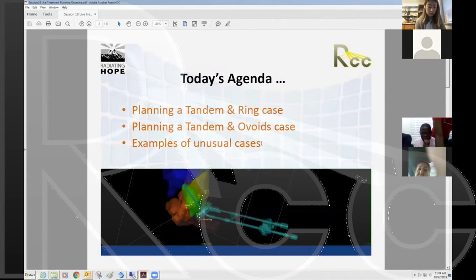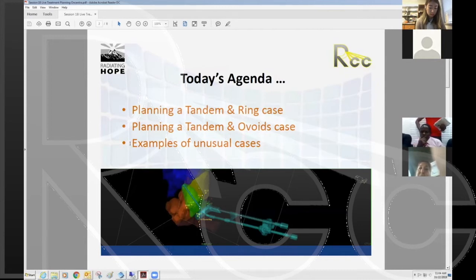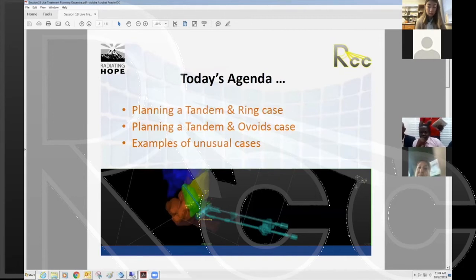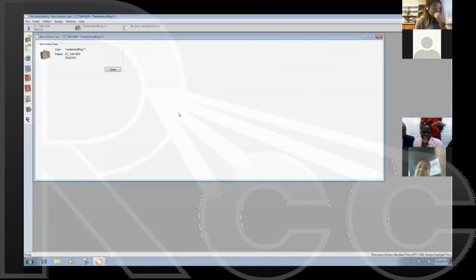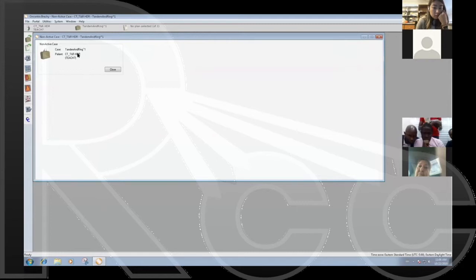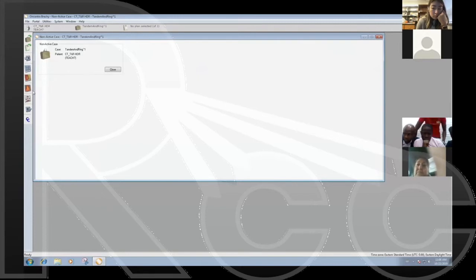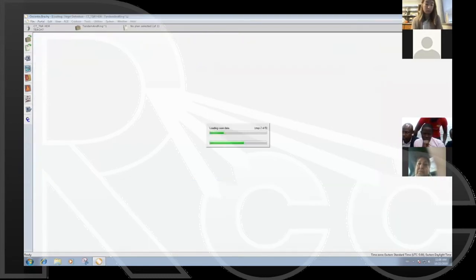Claire Dempsey from Australia was kind enough to share a couple of cases with me that I can present in addition to a couple of my own. So I'm going to share my Oncentra planning screen. This is currently loaded with a tandem-ring case number one, and on the left-hand side you're familiar with the controls: image contouring, image registration, planning module, evaluation, and export.